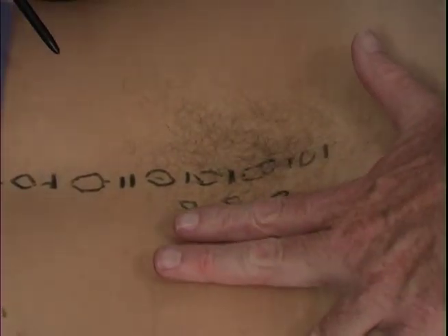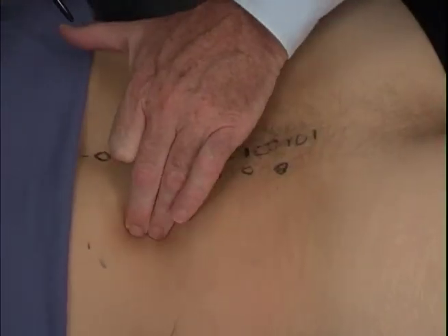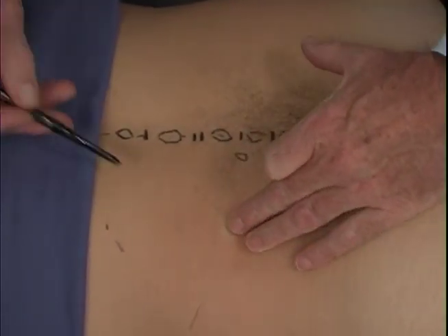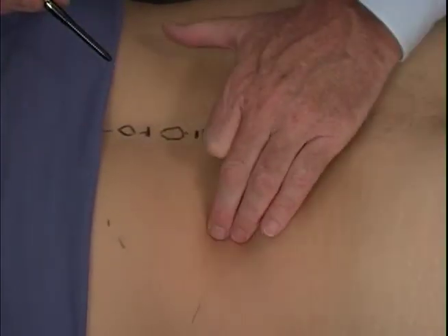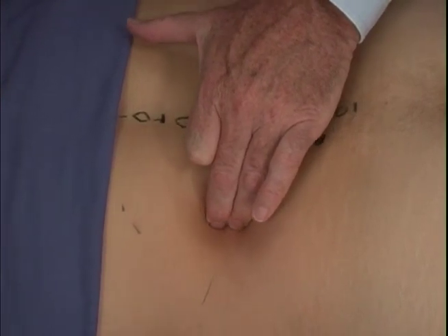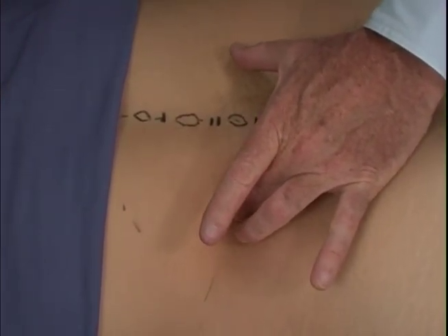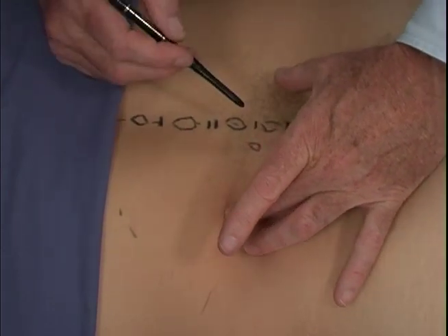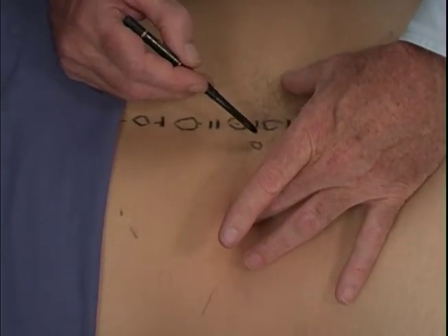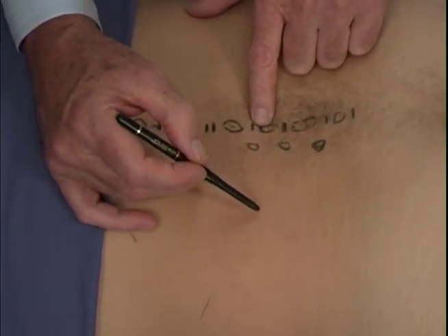Our next landmark will be at the edge of the muscle mass that comes down and spreads out onto the ilium here. And as we come out and we drop off that, we know that the tips of the transverse processes will be right in that area. And they will be in line with the tops of the underlying spinous process approximately.